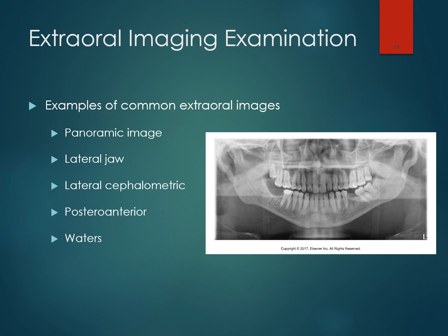It allows us to look at the sinuses. We can even see a little bit of the orbital cavities in this radiograph. We can see at least a little bit of the spinal column along the side. This area right here is the hyoid bone, and we're able to see all of these teeth. You can see that this patient recently had some extractions because you can see these areas in the bone where it looks like those roots used to be, right?